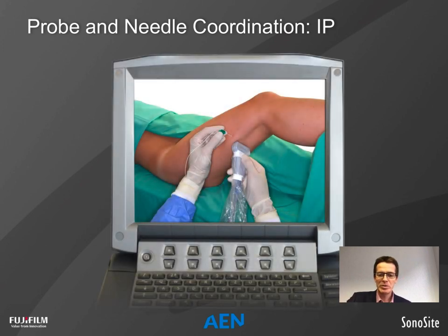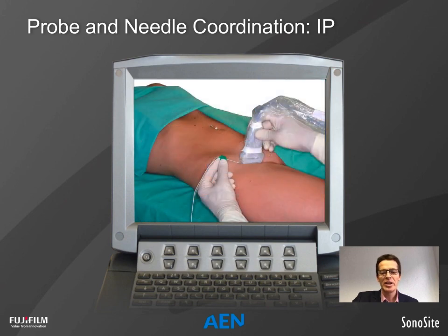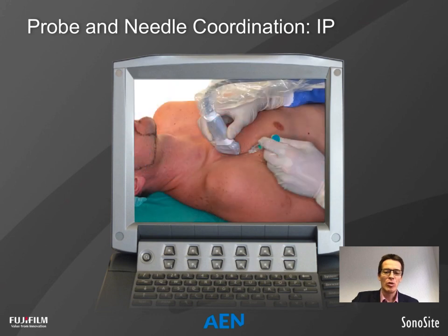And this is possible, let's say, in distal sciatic nerve blocks or in TAP blocks too, but we may have anatomical situations where this is difficult. So the angle of the needle is a little steeper, or in vascular axis here in a subclavian axis, there is no option to have this parallel needle path in relation to the footprint.